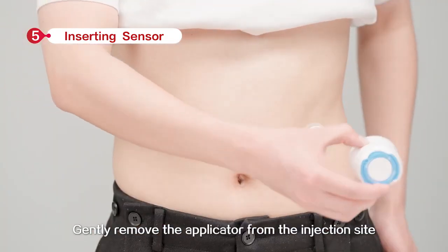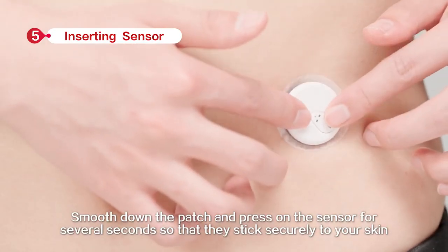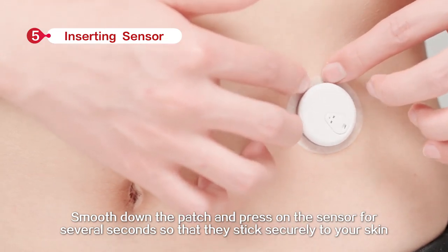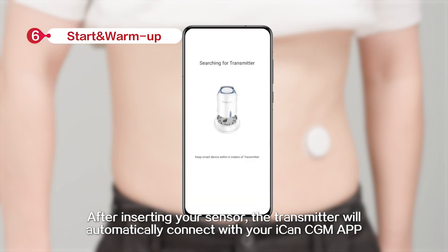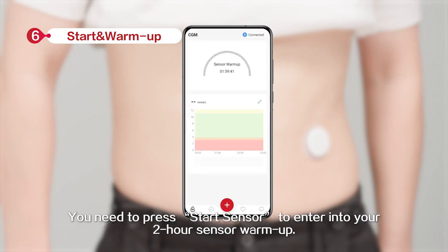Gently remove the applicator from the insertion site. Smooth down the patch and press on the sensor for several seconds so that it sticks securely to your skin. After inserting your sensor, the transmitter will automatically connect with your ICANN CGM app. You need to press Start Sensor to enter into your 2-hour sensor warm-up.